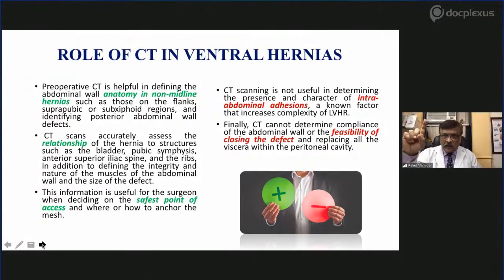Shiva: Yes, sir. Actually, I totally agree with Flavio, and that is what we do in our day-to-day practice. If the hernia size is just 1 or 2 centimeters, then it's okay, you can go ahead with sonography. But for hernias above 2 centimeters, whether midline or lateral, one has to go for the CT scan, and not necessarily with a dye study.